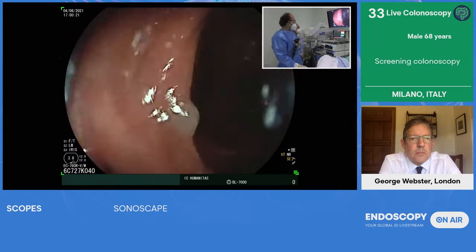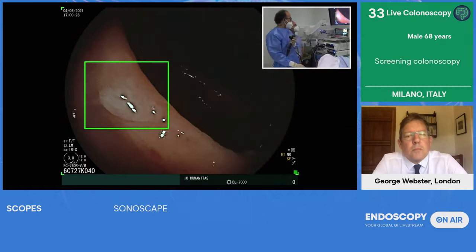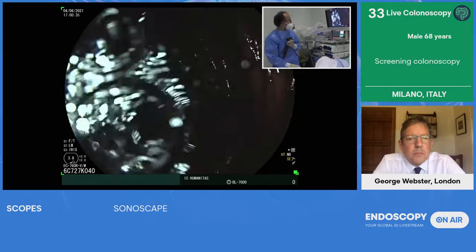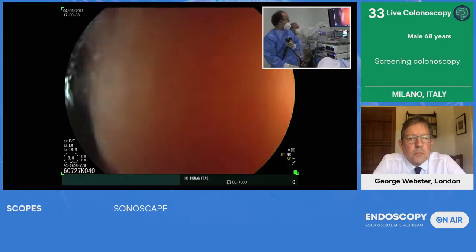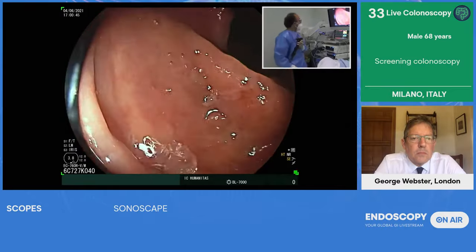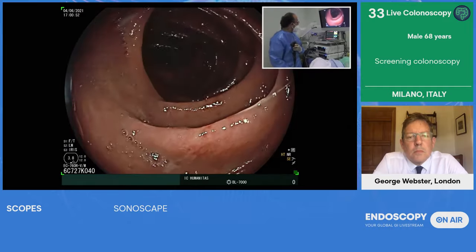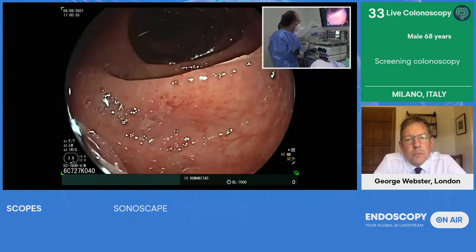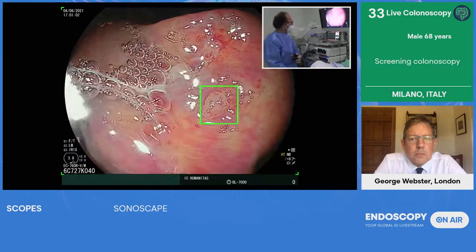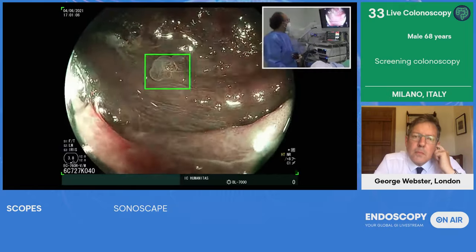This is a false positive, but I don't waste any time. I can wash and I exclude, so it's just a fraction of a second. We showed Ale that these false positives don't make you waste more than 20 or 30 seconds per colonoscopy. And we continue to scope very, very slowly. And now we have an activation, and we relook here, and this was a signal flagged by the machine, and I can now re-evaluate. See how difficult it is to detect an adenoma, even when you know that it's there. And then you see, Ale, how GI Genius is consistent with any advanced imaging. It works with blue light.